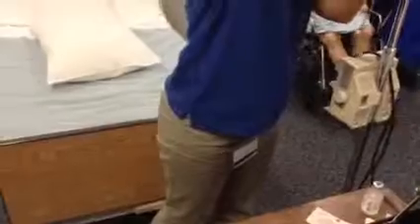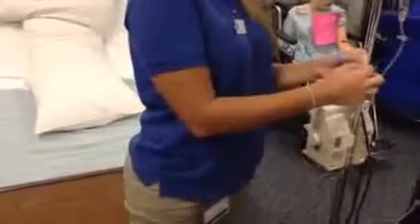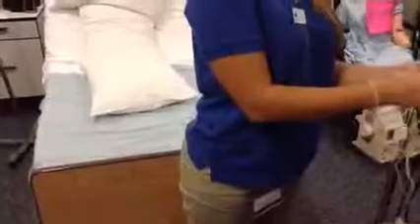Okay, and we got that. And now we're going to go ahead and put the mini bag up. Now we want to label the tubing with the date, time, and initials. So I'm going to go ahead and put the date, time, and initials, and label the tubing. We know that the tubing will be good for 24 hours as well.